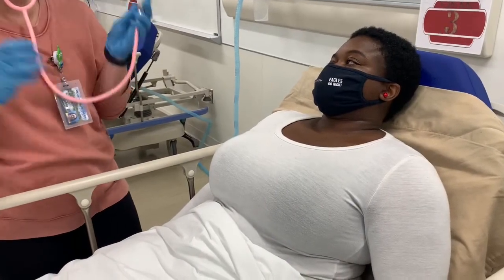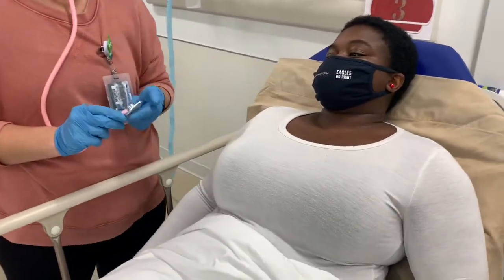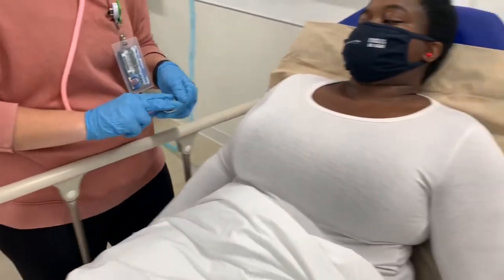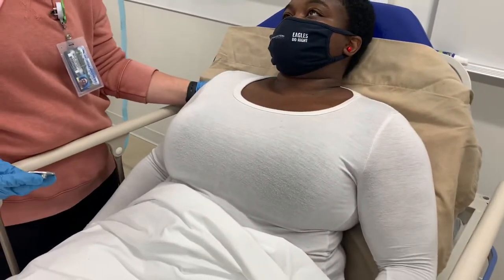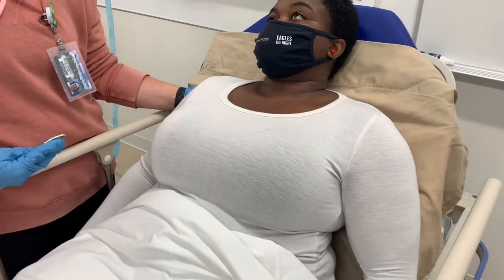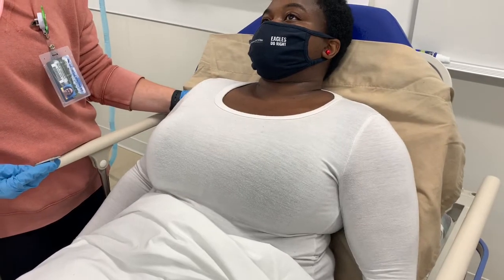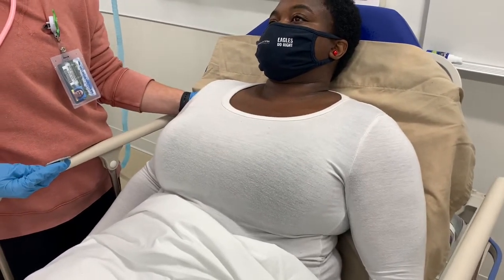Now we start with auscultation. Confirm the patency of the stethoscope by checking the bell and the diaphragm. Optimize the environment by turning off the radio or television. Ensure patient privacy during your procedure. Be sure to position your patient properly.